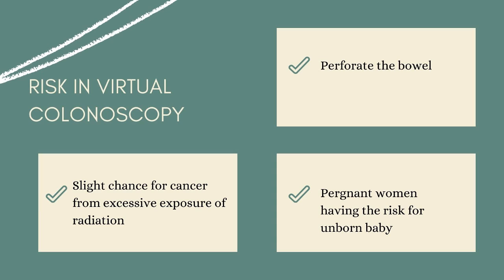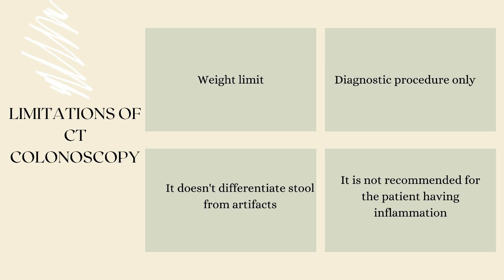Risks in virtual colonoscopy. There is a very small risk that inflating the colon with air could injure or perforate the bowel. This occurs in about 1 in 10,000 patients. There is always a slight chance of cancer from excessive exposure to radiation. However, the benefit of an accurate diagnosis far outweighs the risk. The effective radiation dose for this procedure varies. CT scanning is generally not recommended for pregnant women unless medically necessary because of the potential risk to the unborn baby. These are the major risks in virtual colonoscopy.